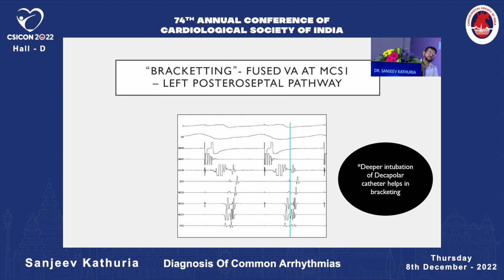But remember, this bracketing can be done on left side pathways, but not on the right. Because on the left you have a mitral annulus, so there you can appreciate with the help of the CS, but that doesn't happen on the right side.